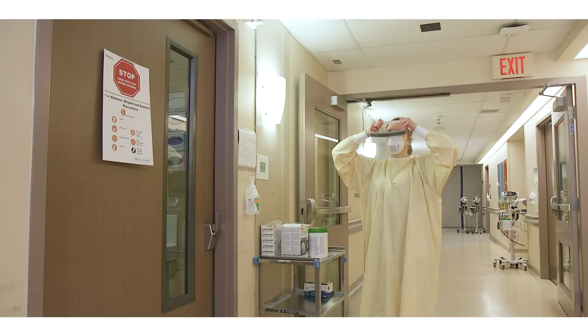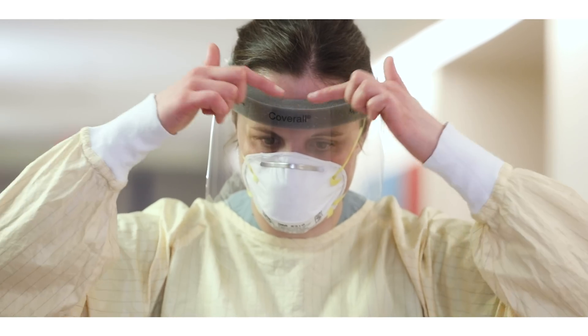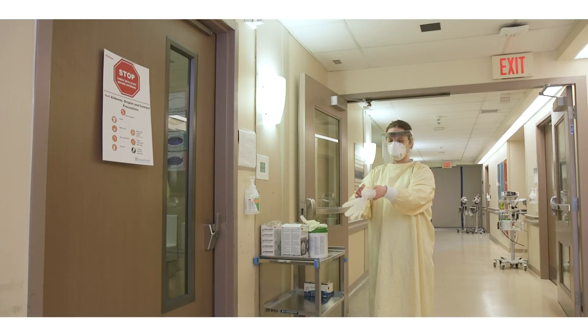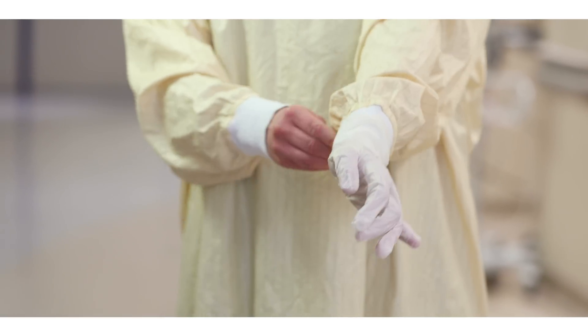Don your face shield by placing the strap at the back of your head. Ensure that the top of the face shield is resting in the middle of your forehead. Put on your gloves, ensuring that the gloves are placed over the cuff of the gown so that the skin of your wrist is not exposed.